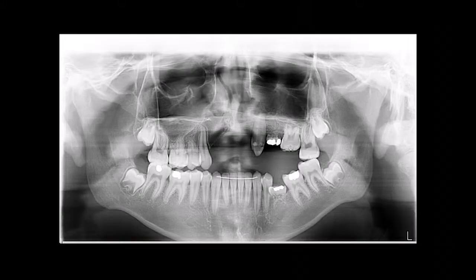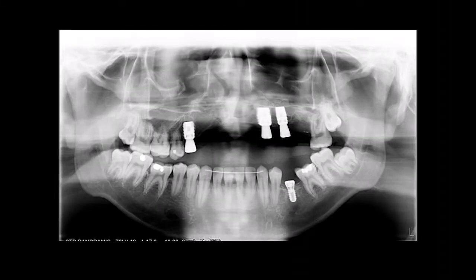This guy's name is Andrew Dugas. He's got all this stuff going on. They put him in braces. Somebody put him in braces. And they really, I don't know, it seems they didn't do anything. It still has a big anterior open bite. This was retained. Maybe that could have been moved. I don't know. But it was just kind of, I don't know. Anyway, we did this, put these rescue implants in on the top.